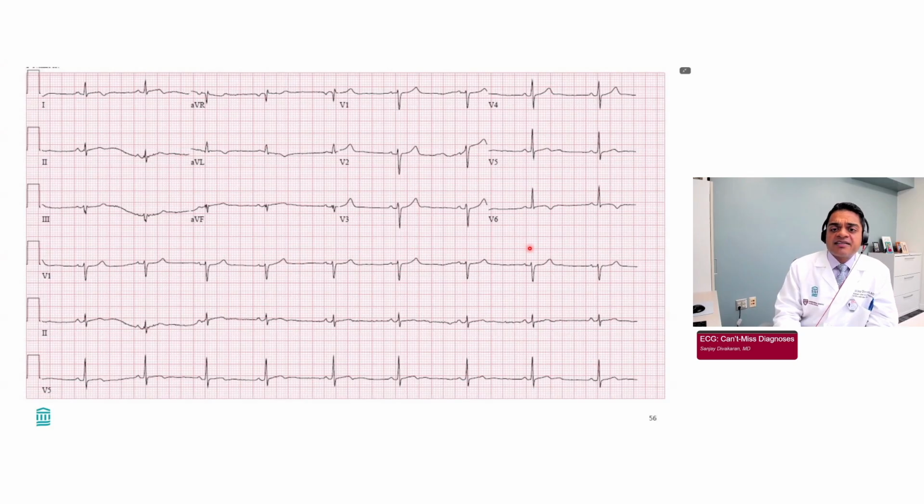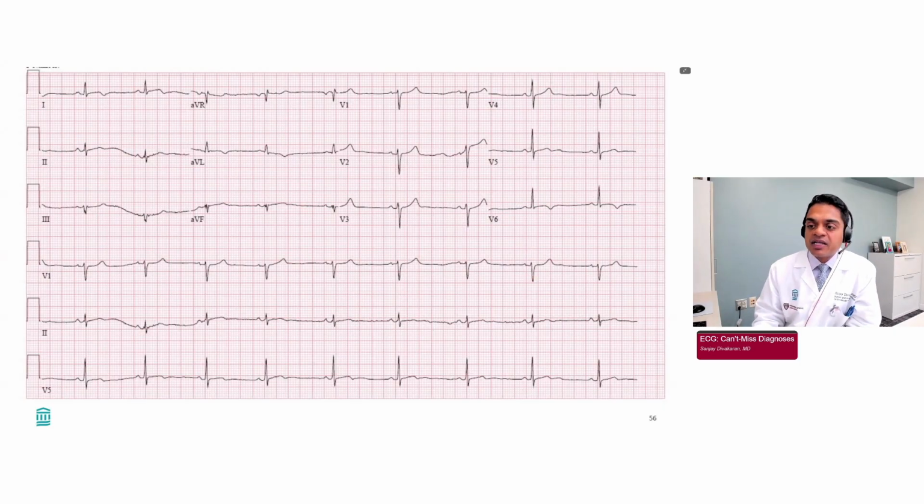And so we're going to get into this a little bit, but what is the differential diagnosis for patients who have chest pain, abnormal ECG, and elevated troponin? And my top three, in the absence of coronary disease, are myocarditis, stress cardiomyopathy, or pulmonary embolism. This patient indeed had an MRI done later in the stay and actually showed distal, inferior, and anterior wall hypokinesis and late gadolinium enhancement consistent with myocarditis. There's also evidence of edema by T2 weighted imaging. And so pointing out here.